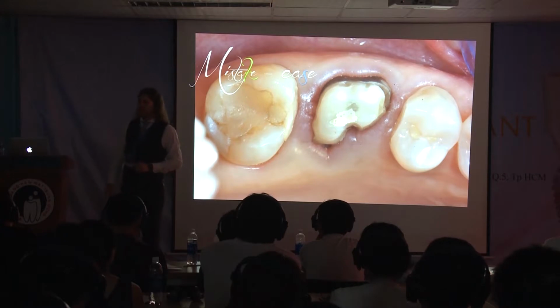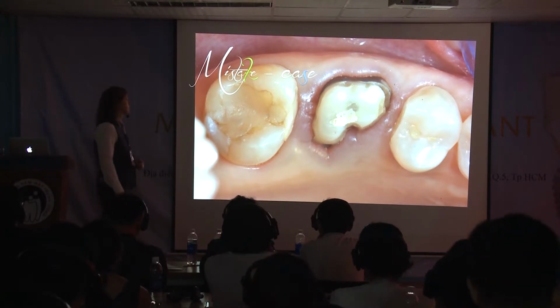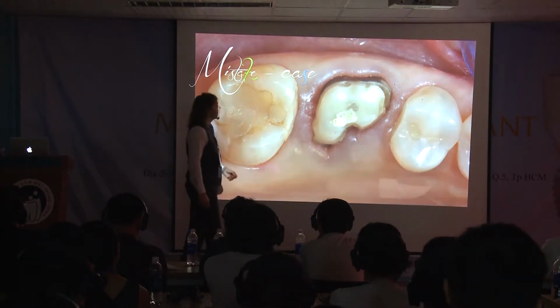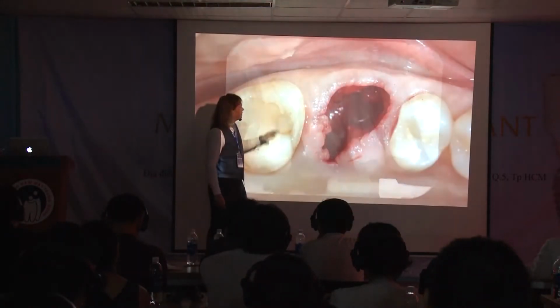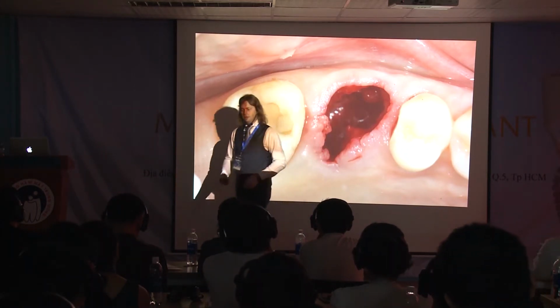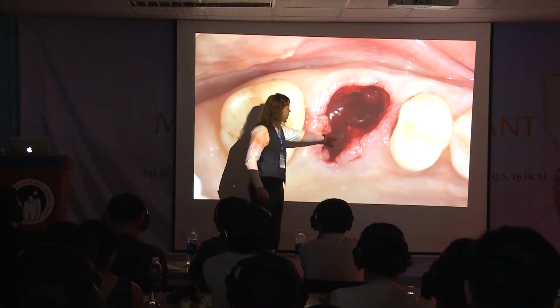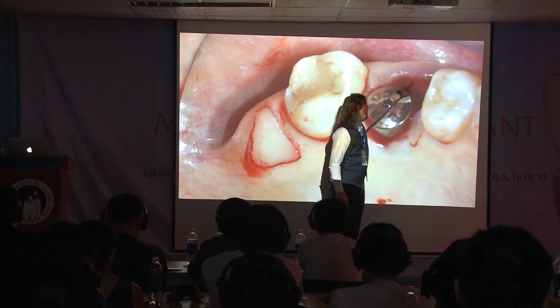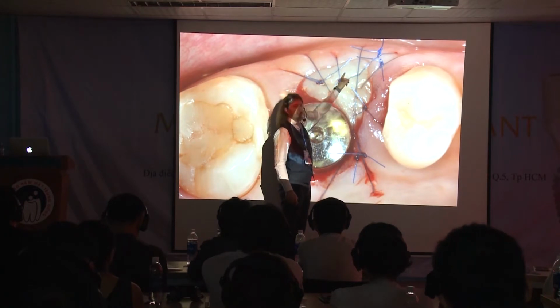But I want to show you a mistake case to understand how dangerous it can be. It's like a beast. When we remove this tooth, there is a cavity here, an infection everywhere. So we remove it, then we have to remove this granulation tissue, cleaning very well, also with antibiotic inside the root. And then I place an implant here. This is another very old case, so you see old implants. And here there is a gap, and I will graft from the tuberosity to fill this gap.